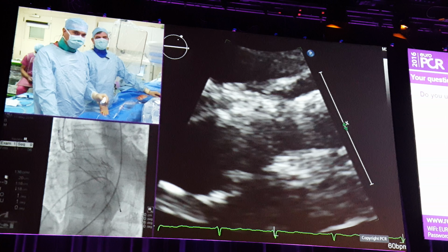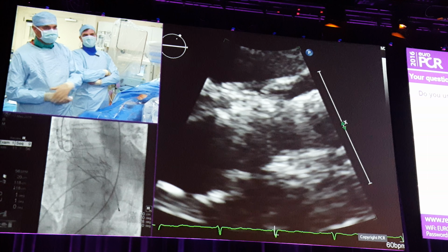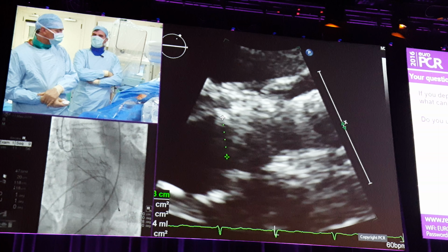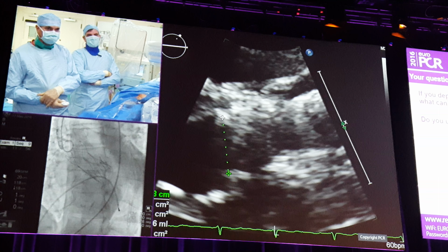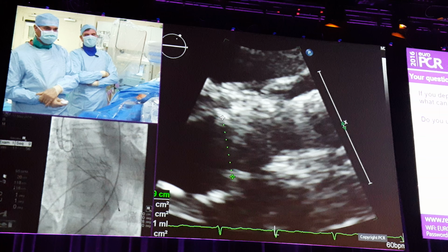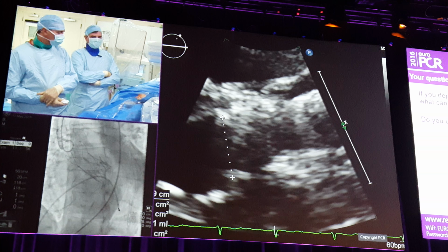Okay. And it's important, as Helga and Thomas know, that the ratio of the balloon post-dilatation is pretty much 1-to-1. You don't want an oversized balloon that might result in dog boning and trauma to the mechanics of the valve and the metallic structure of the valve. So the sizing of the post-dilatation is of fundamental importance.